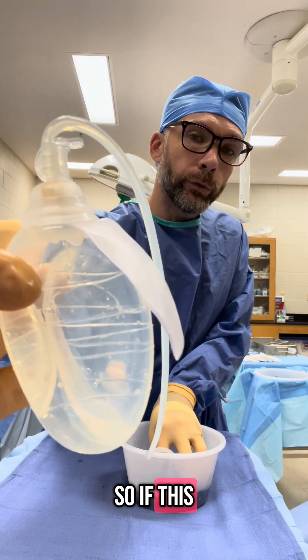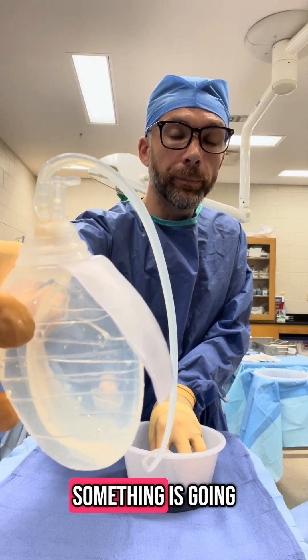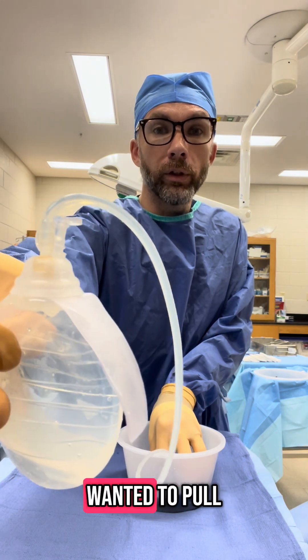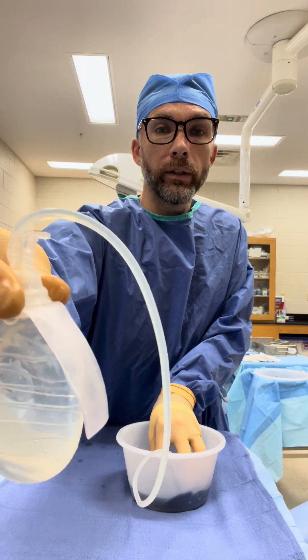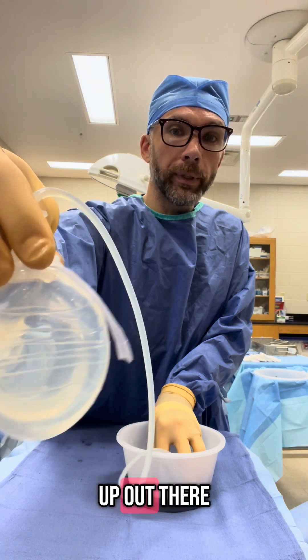So if this was in a wound and it had blood residually in the wound, or it had something that was going to leak a little bit, if you had irrigation or anything you wanted to pull out of the wound, you could leave a drain in and it's going to pull it up out of there.